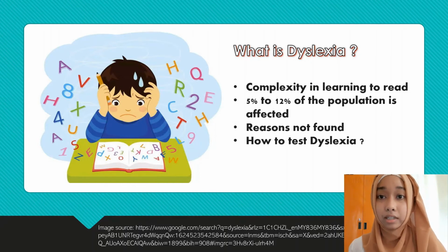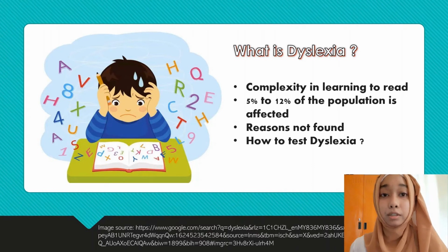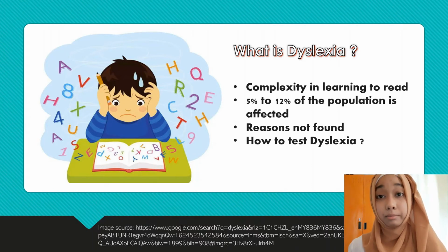Regarding this analysis, the brain signals are collected from subjects by using an electroencephalogram machine. The experiment is conducted by following a standard protocol for an EEG machine. To complete the analysis process, an elliptic filter is used for pre-processing, Mel frequency cepstral coefficients are utilized as a feature extractor, and a multilayer perceptron as a classifier.